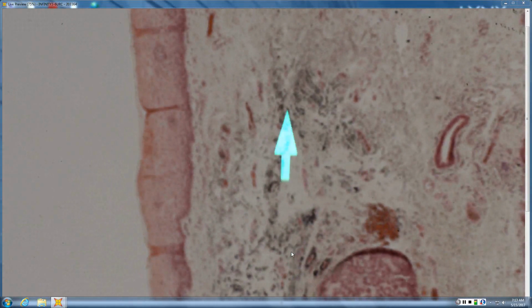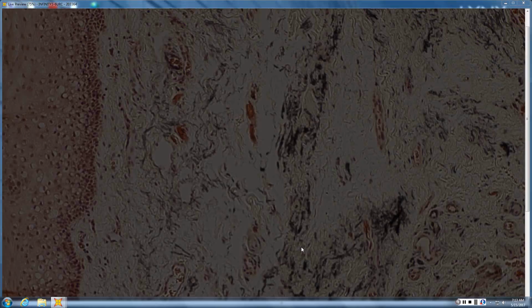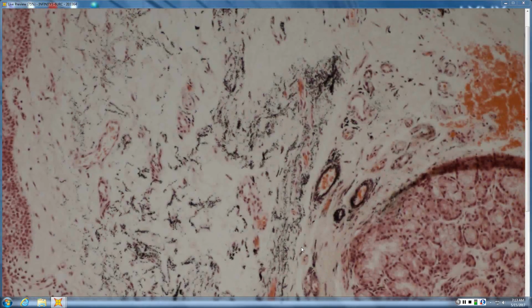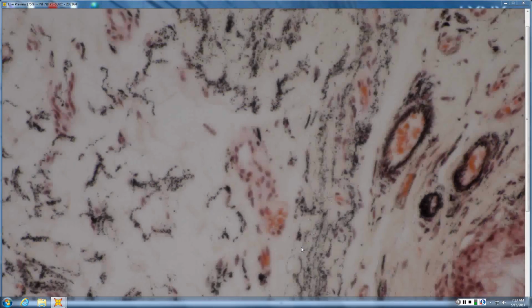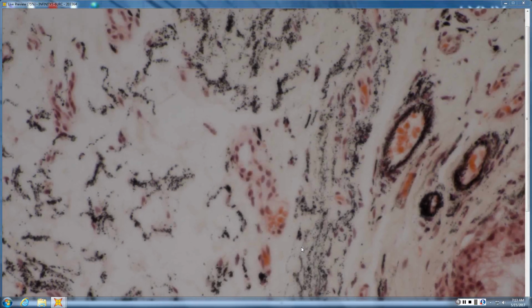But this black area here is the amalgam tattoo, and it can be from mercury and silver and other things. That amalgam can produce what clinically appears to be, sometimes, melanoma, and so that's why we biopsy it. This is sort of what it looks like, just these fine little particles, a little bit more diffuse and with a fine wispy appearance than a true tattoo that's more man-made, injected. So that's what amalgam tattoo looks like.